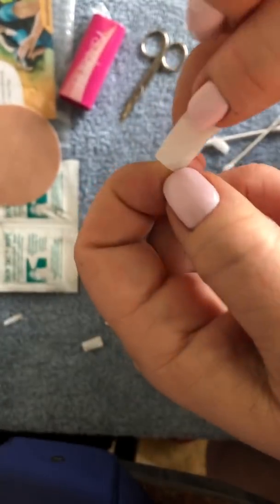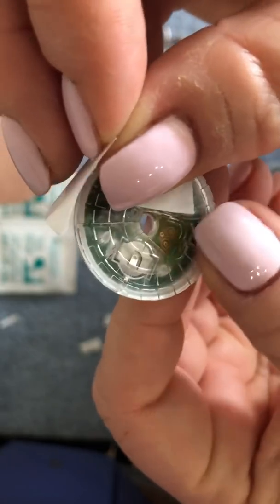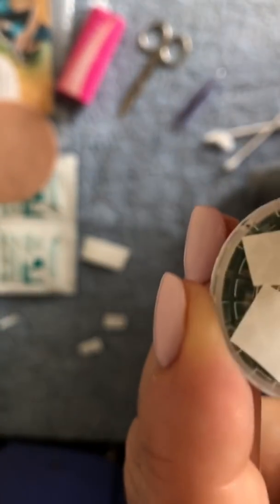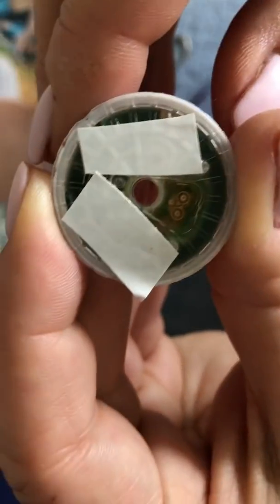So the double-sided is on this side. So what I'm going to do is I'm going to take the sensor again. If you look, there's a triangle. The triangle is right at the bottom. I'm going to put this piece right here. Okay, again, making sure that I do not touch either the circle or that little triangle thing there.